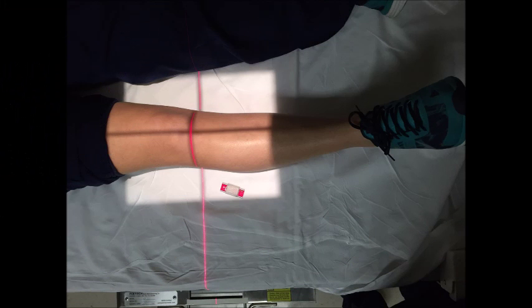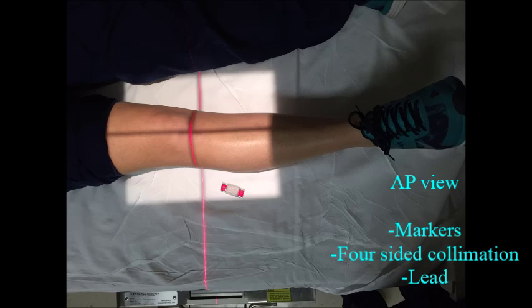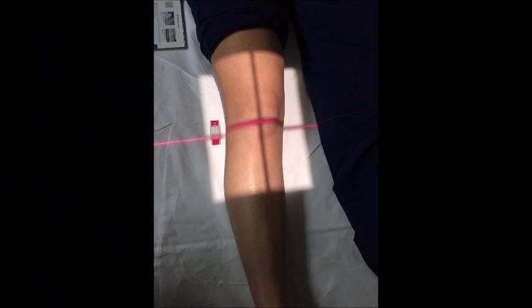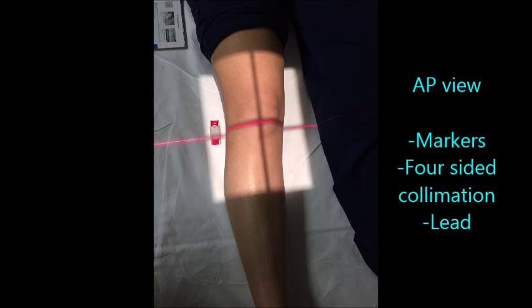For the AP view, direct your central ray half an inch distal to the apex of the patella. Make sure epicondyles are parallel to the cassette. Sometimes patient thigh and butt thickness will determine the angle of the tube.